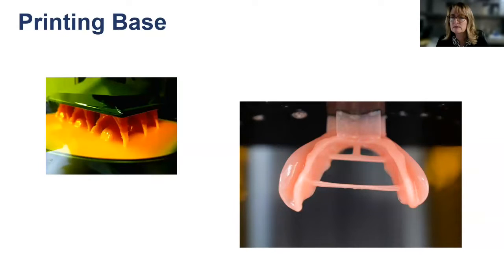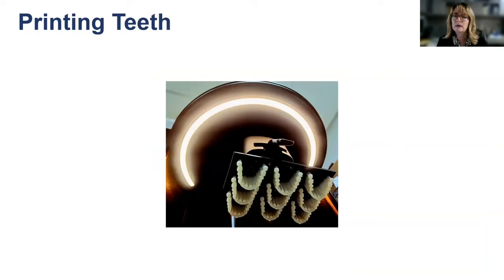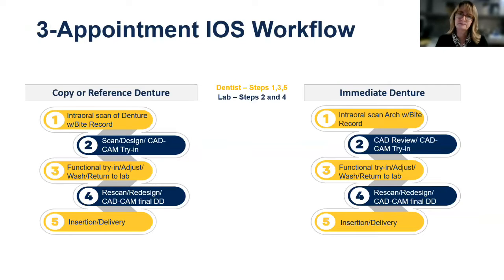And so these are some images of the actual print happening. And the material that we are using is DLP. It's the Dentsply Lucitone Print. And so you can see all of the arches, right? All of the gingival tone bases being printed at the same time. And then all of the teeth printed at a different time. So they're printed separately, and then it's going to be a mechanical as well as a chemical bond.